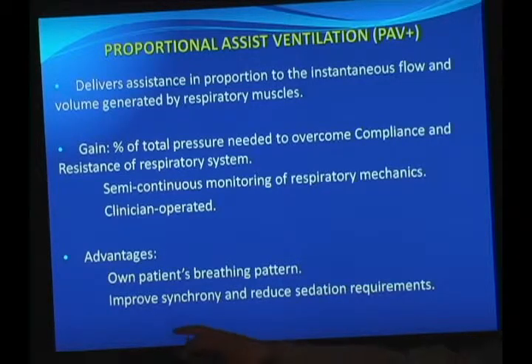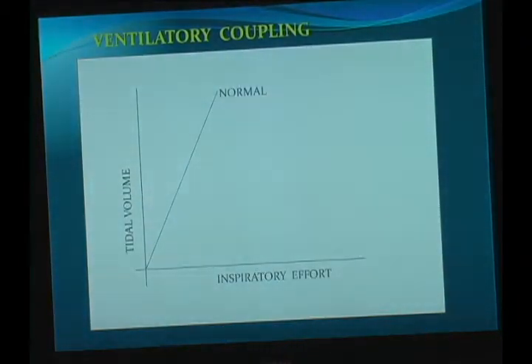The supposed advantages are that the patient can maintain his own respiratory breathing pattern, because we only support his respiratory muscles by adding pressure in each breath, but the patient is able to decide the rate that he wants and the tidal volume that he wants. And it's clear that this improves synchrony and reduces sedation requirement, because the patient is more comfortable. And this is a regular finding observed in any study.